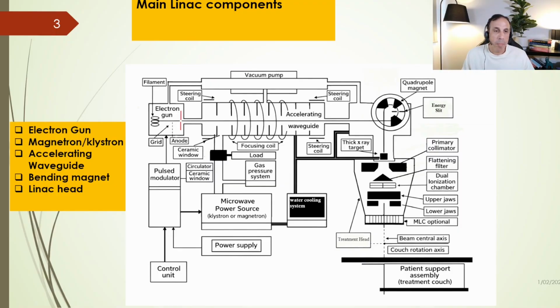The main thing in the electron acceleration happens inside the treatment machine, which can be seen on this figure. If we look inside the Linac, we can see how all these parts work together to deliver a precise radiation therapy.